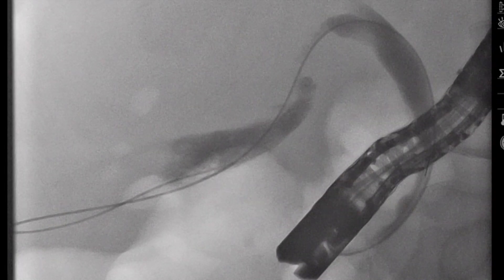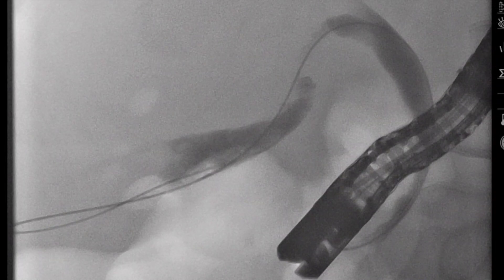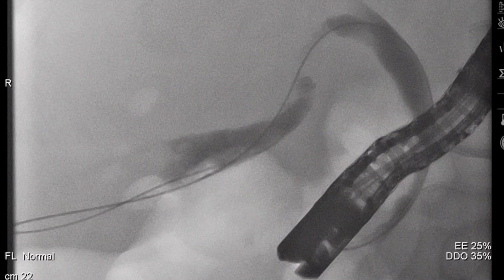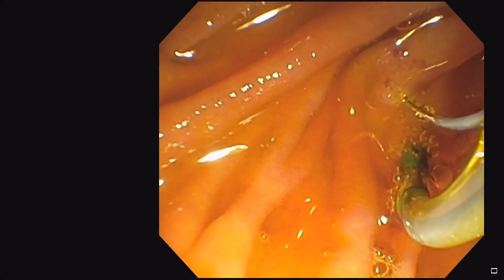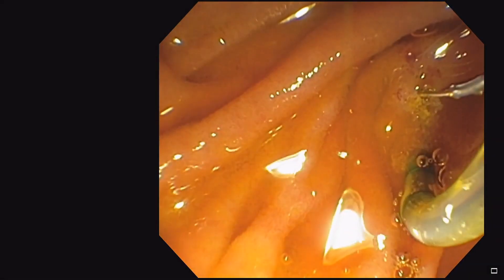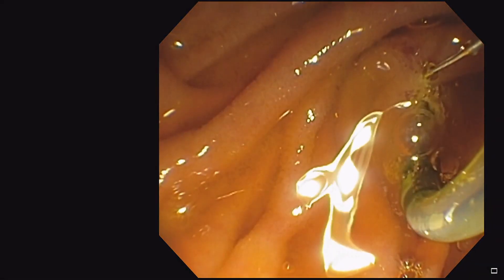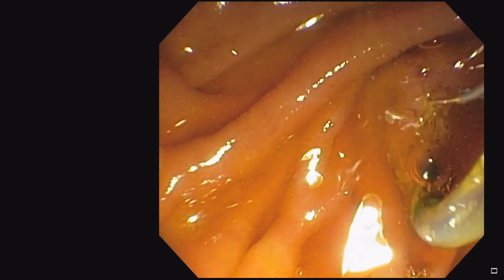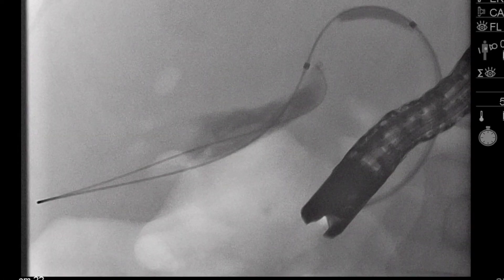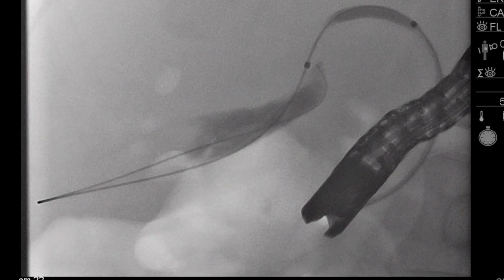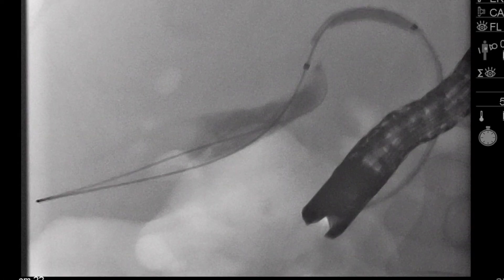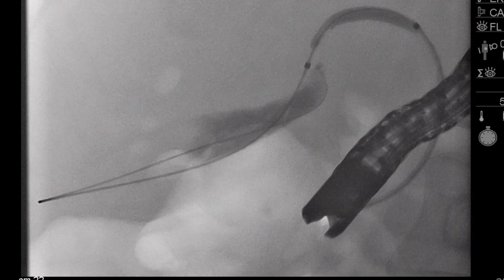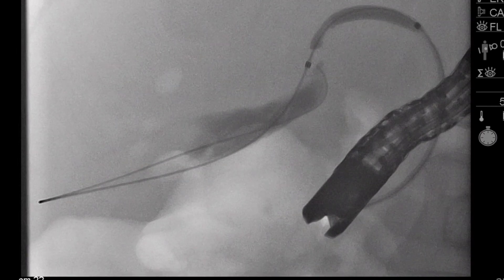Even after the wire is advanced into the gallbladder, forming an adequate loop is essential to maintain access for passage of instruments. A standard sphincterotomy can then be performed, followed by dilation of the cystic duct — in this case with a 4mm biliary dilating balloon — to treat any high-grade strictures and facilitate stent placement.